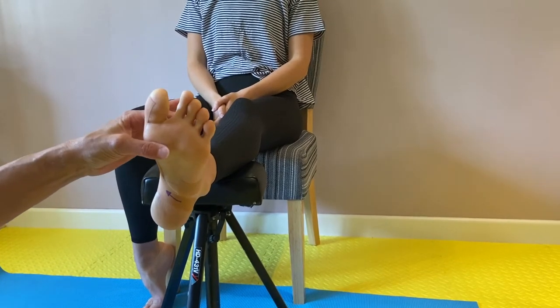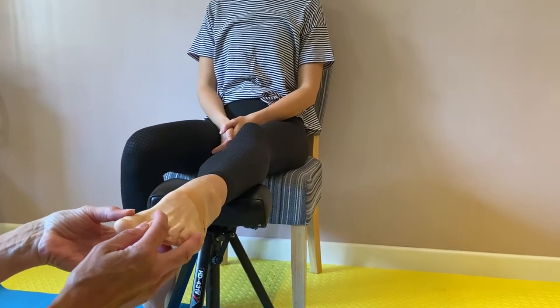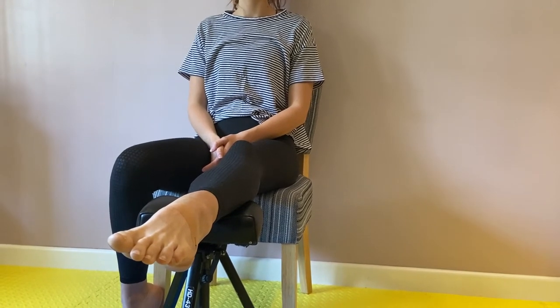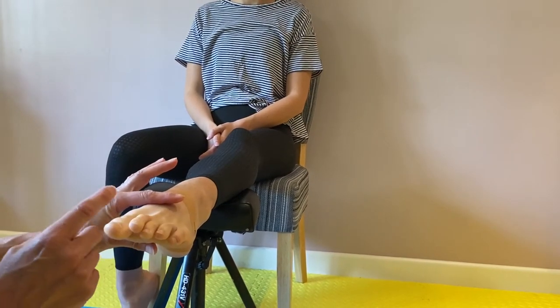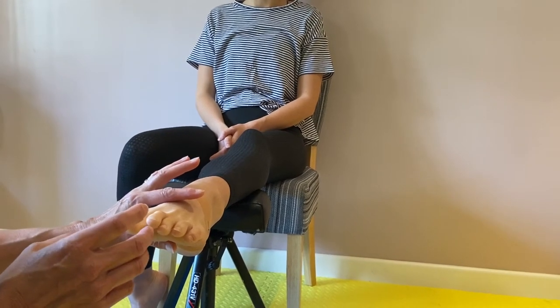I'm often asked if there's anything that you can do with a bunion deformity other than have surgery. There are certain things that you can do in the early stages which will pull the toe into slightly better alignment and make you more comfortable. This young lady doesn't have a bunion deformity but I'm going to show you how to do this taping because it's a little bit tricky to do.